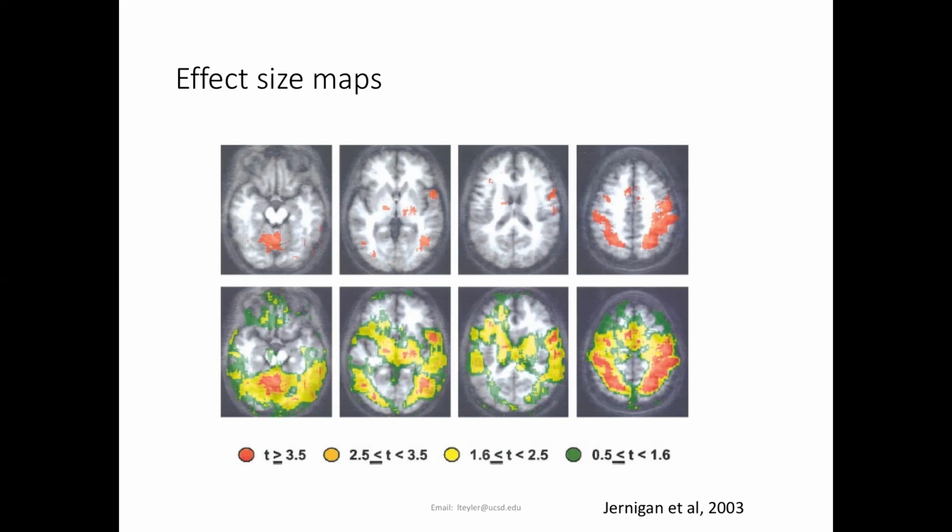But then if you look down here, near the insula, you can see that yes, there is that hot spot here, but it's not like there's nothing going on over here. And probably if you did a direct comparison between this activation and this activation, it may not be statistically significantly different. It's a little bit lower in magnitude, but it's not that it's absent there, and yet it makes it look like it's absent when we do this thresholding that we do.